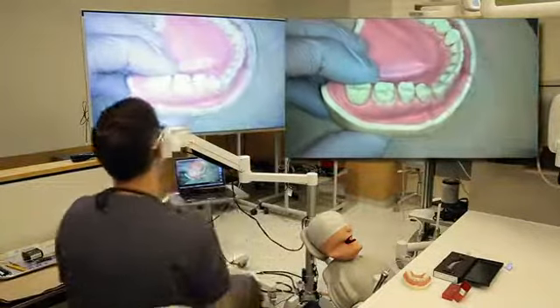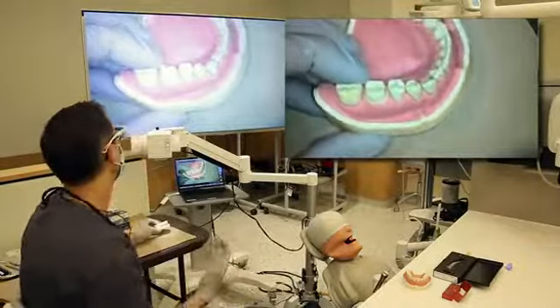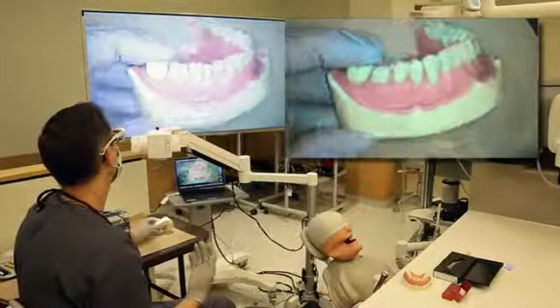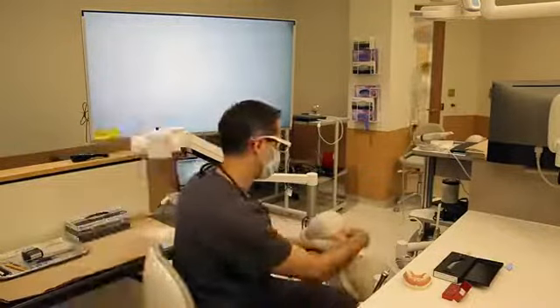One of the other things, technology that we have not used for our students, but actually is available for clinicians in private practice, is using this in order to do a preparation, actually.